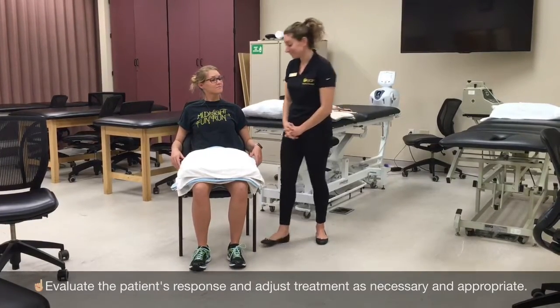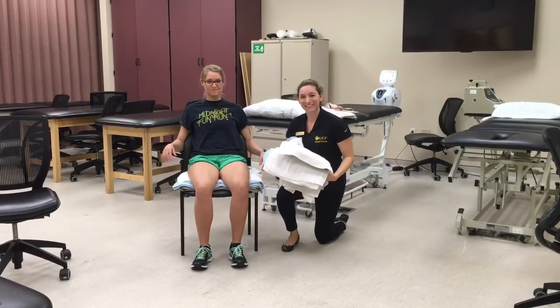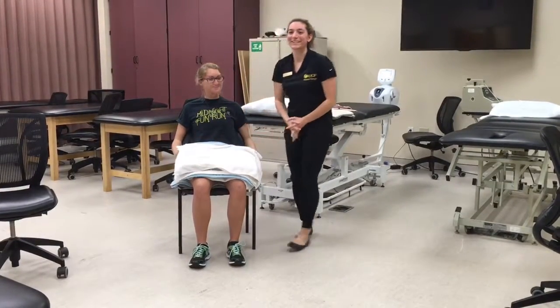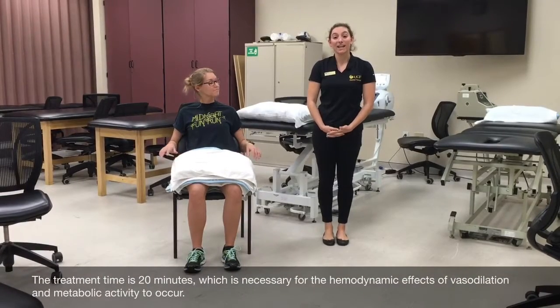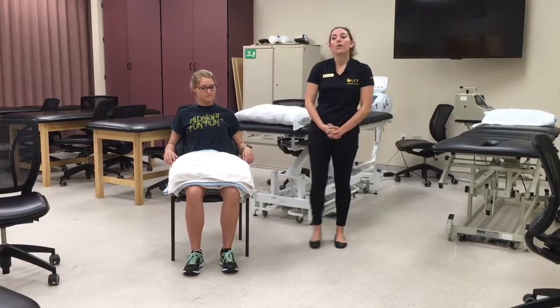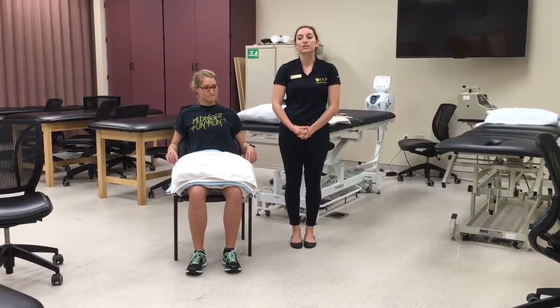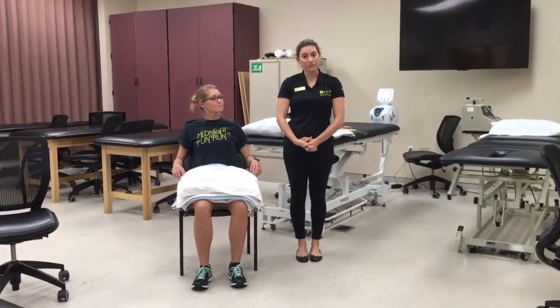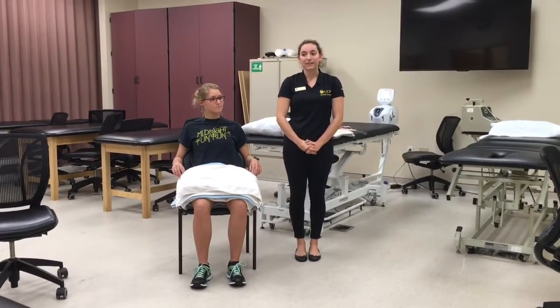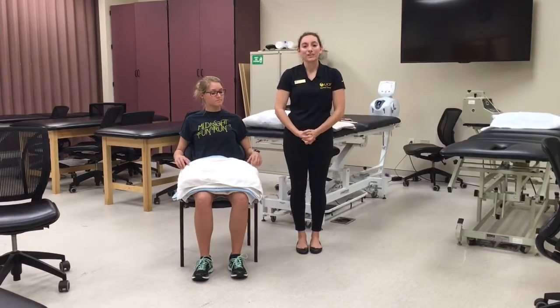Five minutes has passed. Skin integrity is good. There is no excessive blistering or redness. After the treatment, I will examine the patient's skin again and reassess progress towards goals. Expected outcomes include improved circulation of her distal lower extremities and increased availability of oxygen to improve circulation due to the increased tissue temperature. The use of heat is indicated in delayed healing scenarios like my patient who is in the maturation phase of healing. This should help with her goals.